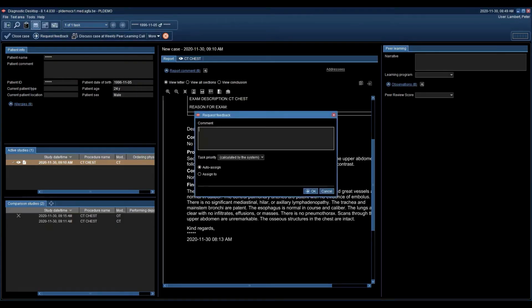It features the possibility to trigger peer reviews manually or automatically, and it offers anonymized built-in feedback loops that allow authors to learn from the advice of colleagues. Another key property of our peer learning module is its configurability. Workflows can be easily tuned from very simple to pretty advanced.